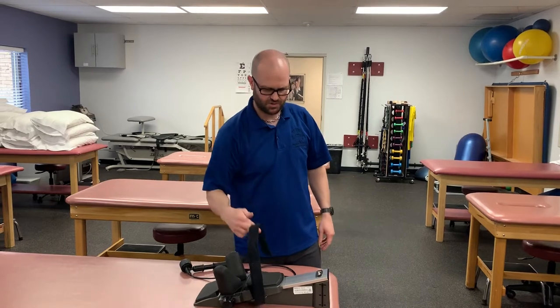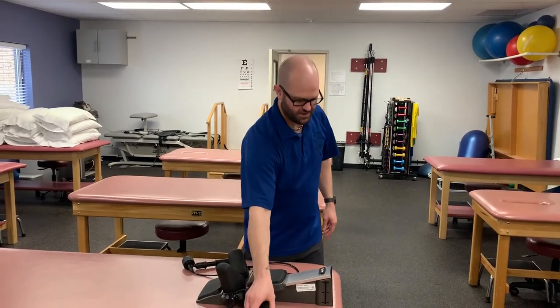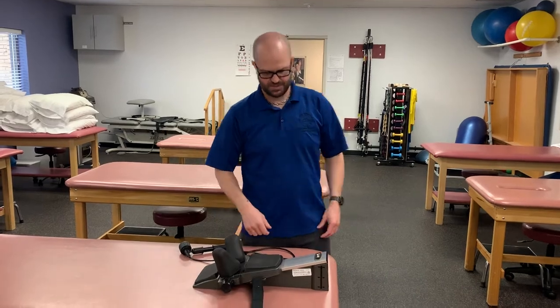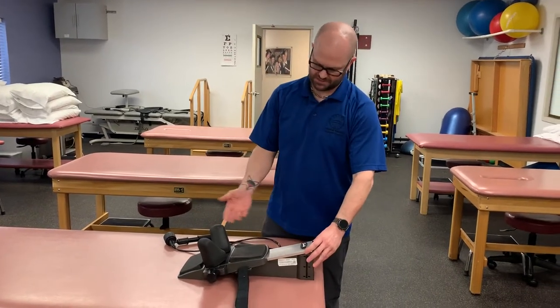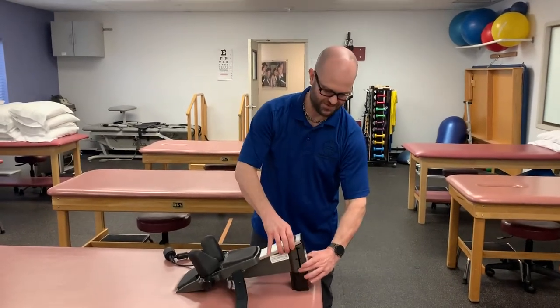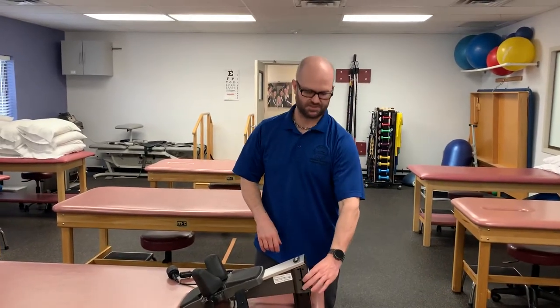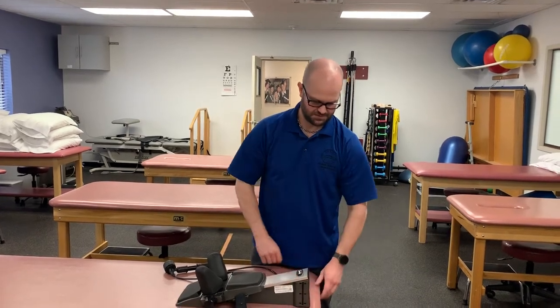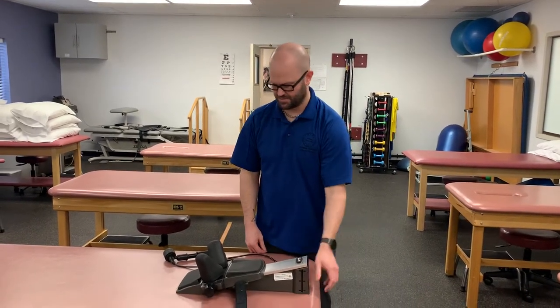We have a little strap that's gonna go over their forehead if they're comfortable with it. If not, don't worry about using the forehead strap. This machine also puts the patient in a slight amount of cervical flexion. However, if we want to increase that flexion, we've got two little tabs here that'll kick down a foot to increase the amount of flexion.